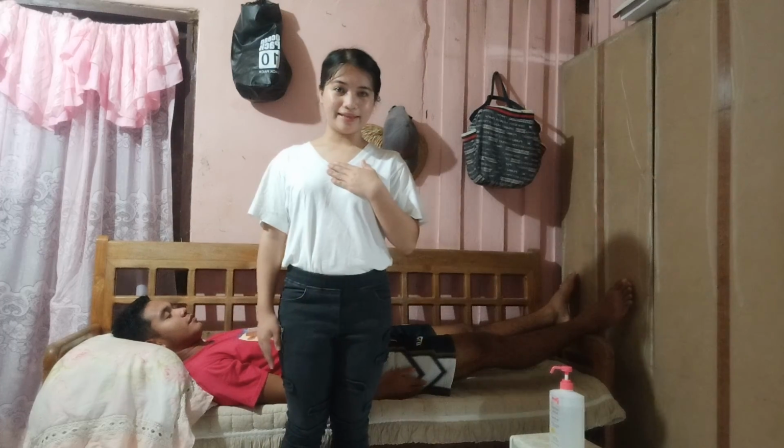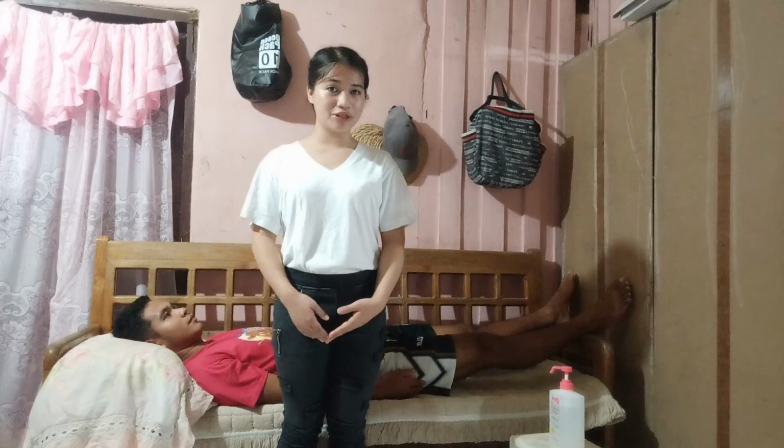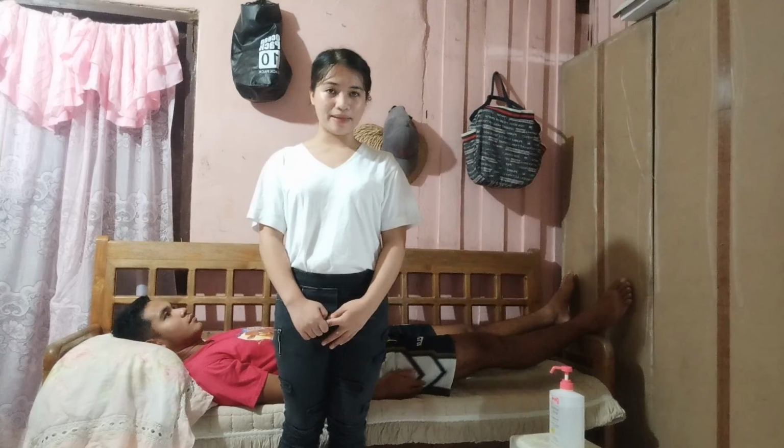Good day, my name is Glenda Lindangan, a first-year nursing student at Central Mindanao University. In this video, I will be demonstrating the procedures on moving a client up in bed.